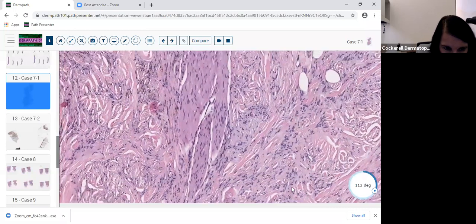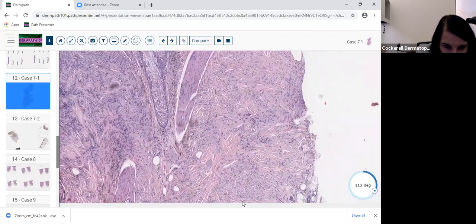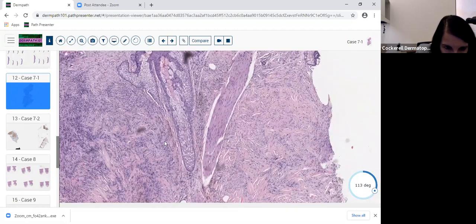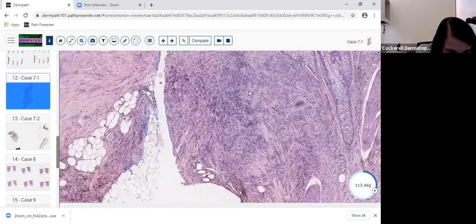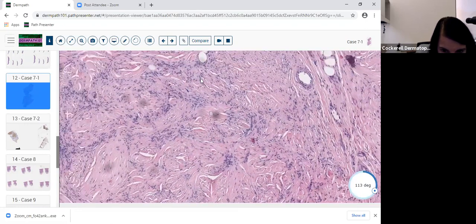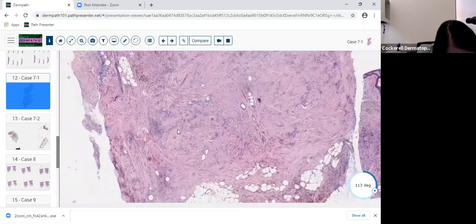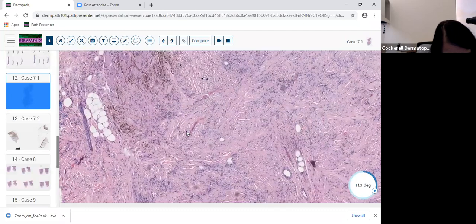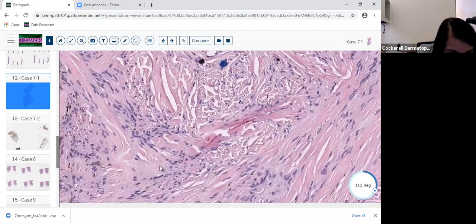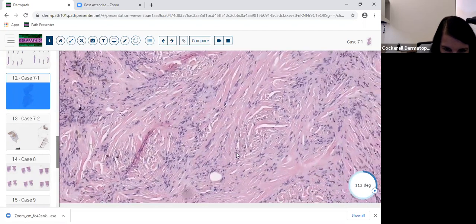And then I have this structure here, which I'm not sure, is it smooth muscle or is it nerve? It's kind of big, but is it smooth muscle or nerve is going through my head right now. It's sort of near this follicle, so it looks like it's pilar smooth muscle. But then I have other areas in this tumor that are very strange and that look somewhat neural. I'm trying to find it better. Somewhat neural areas. You have to really study this tumor. Some of this sort of looks wavy and it somewhat looks neural to me. And that's Schwannian differentiation, the so-called Schwannian differentiation.